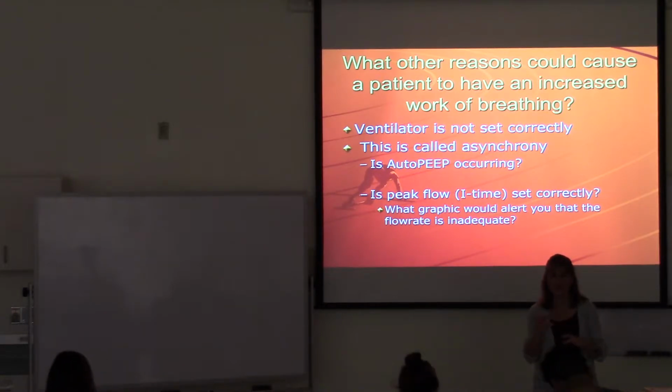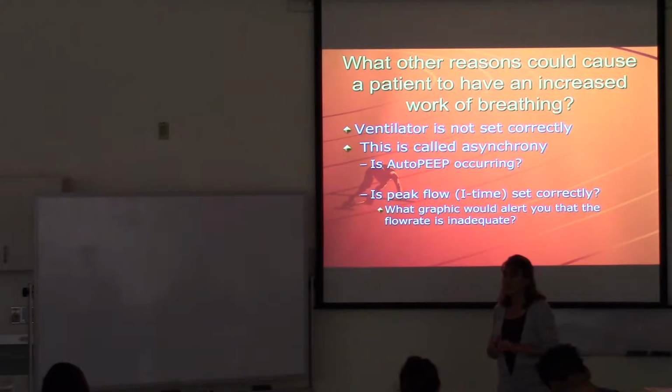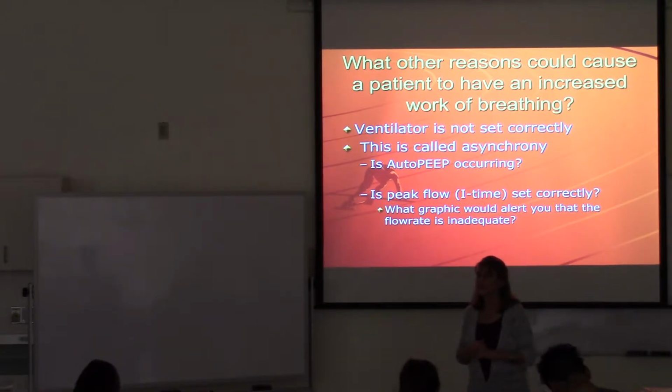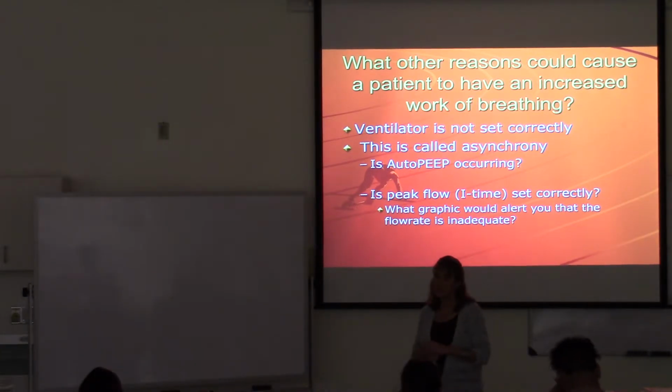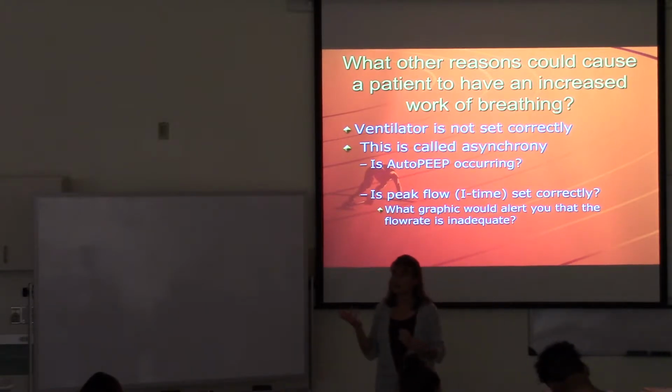Happens in volume modes of ventilation. Inspiratory pressure will not rise.